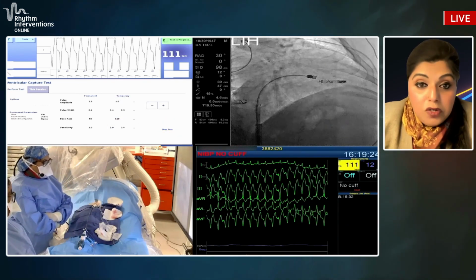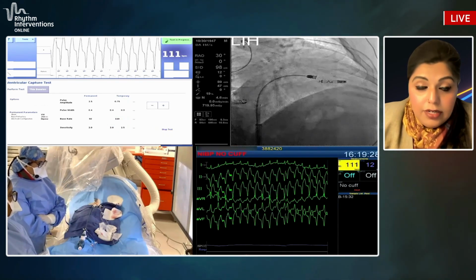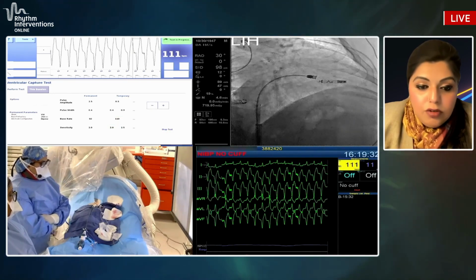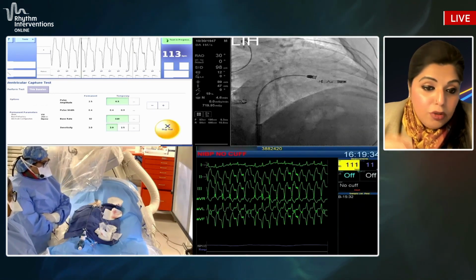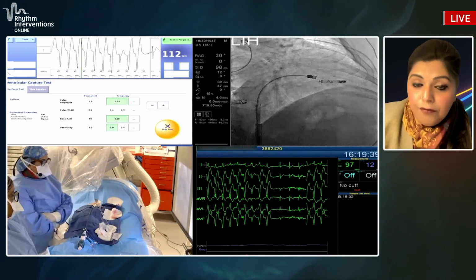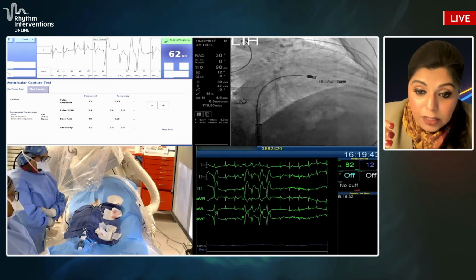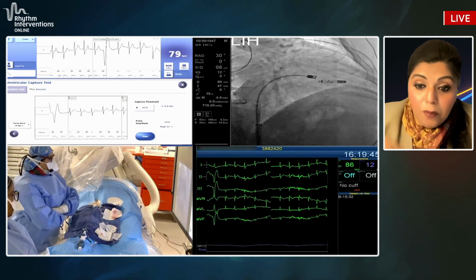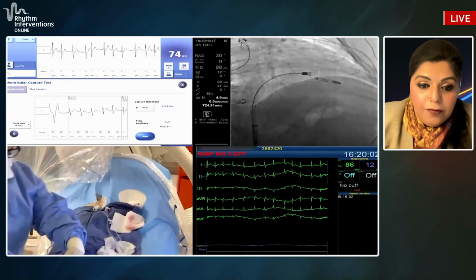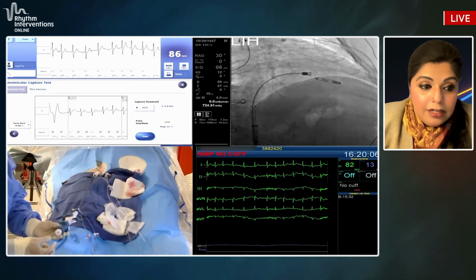You could say if your numbers are bad, you could reposition at this point if you needed. You could actually retract the helix back, put the protective sleeve back, and reposition it and redeploy it if you needed to. But the 3 things that you're looking for is good electrical measurements and good trends from your pre-mapping. You're looking to make sure that the leadless pacemaker is moving adequately and appropriately with the cardiac cycle. And then you want to make sure that you had a very stable deflection test. And once you have that, now you're ready to kind of release it.